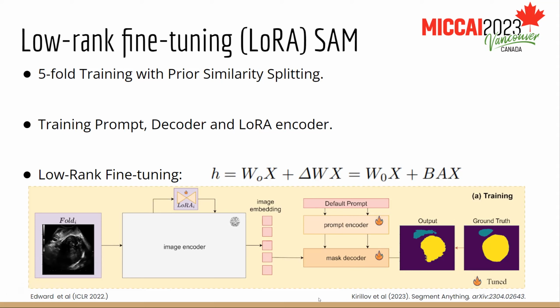It was published at the beginning of this year, and they trained the prompt encoder and the full prompt normally, as if they are normal parameters. Okay. I have one more question about the training data, because this is an ultrasound image. How did you set up the prompt for each image? Or did you do that a different way?